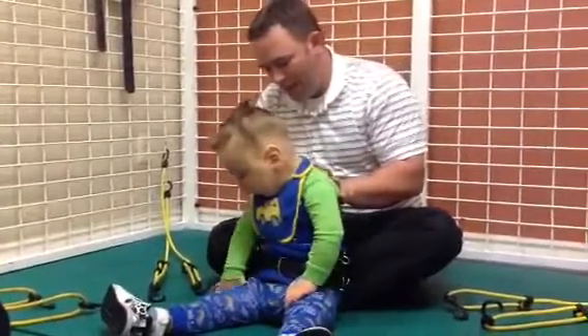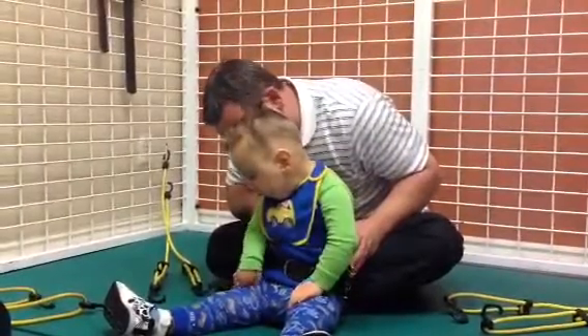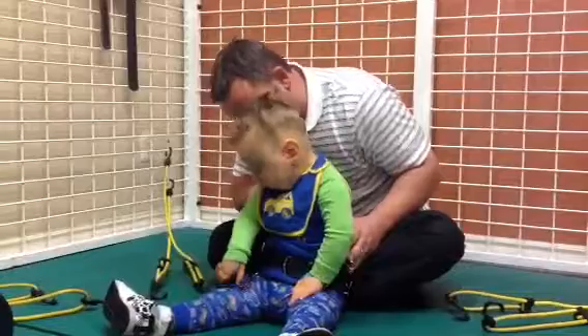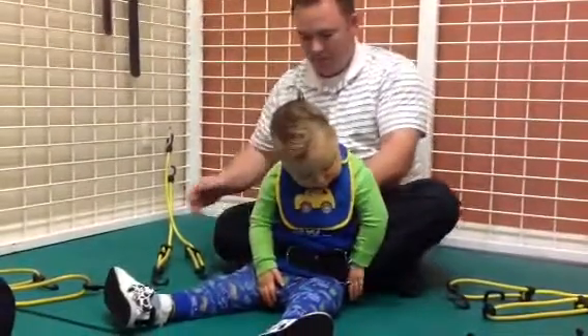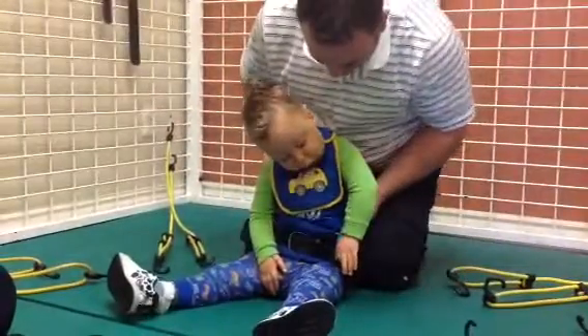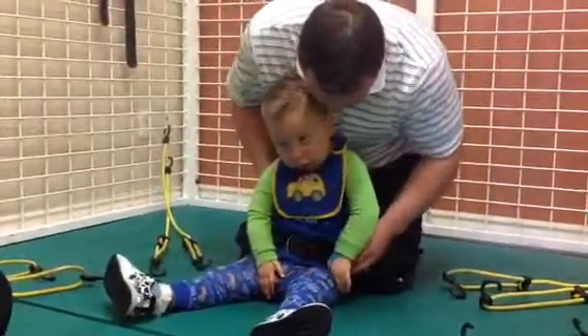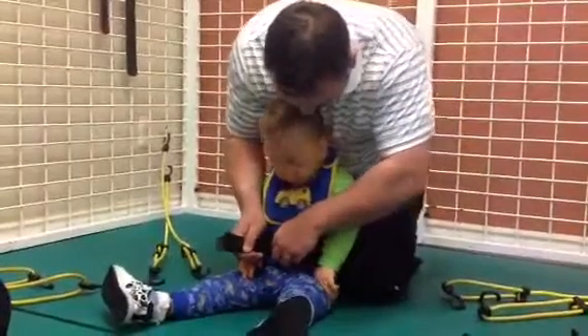Are you getting Mark's toes? He did his toes. Find his toes over there too. There's some on this side, there's got to be some on the other side. Oh, he's getting the belt. Pull it out. Thank you. Thank you.